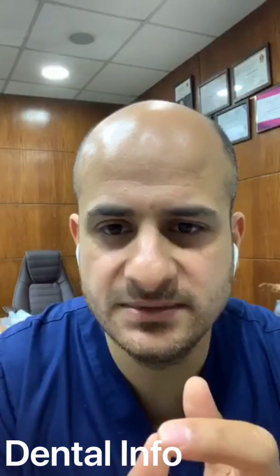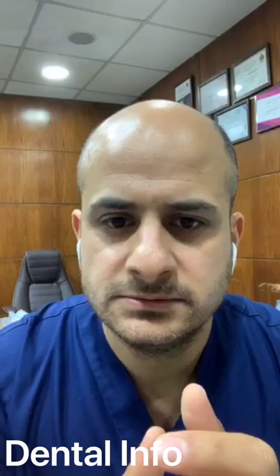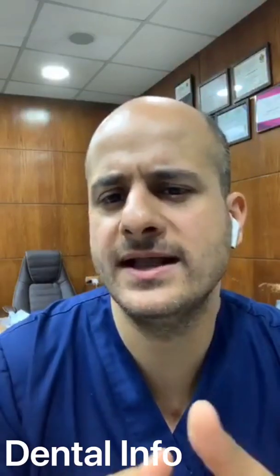Is it better to cut, let's say, 1 millimeter of the... Yes, Dr. Ahmed here is asking, for example, for me, 3004 was good with the weak tugback. Why did I not modify the tip size? Okay, you can do that. Of course, you can do that, and that's not wrong at all.